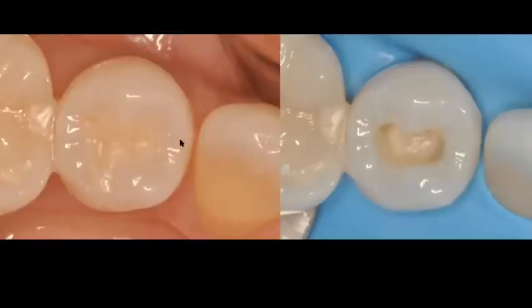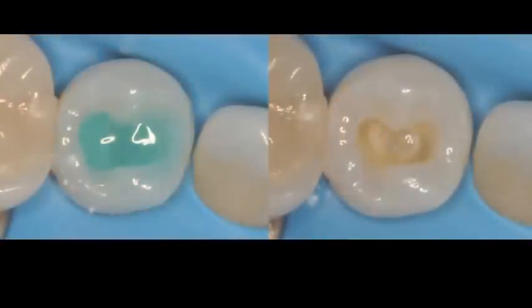And again, I have here a mandibular premolar that I'm going to go ahead and restore. You can see that it has a little distal lingual cusp and a mesial lingual cusp. So there's a little groove here. I immediately know that this is probably going to be a Y-shaped type of premolar.